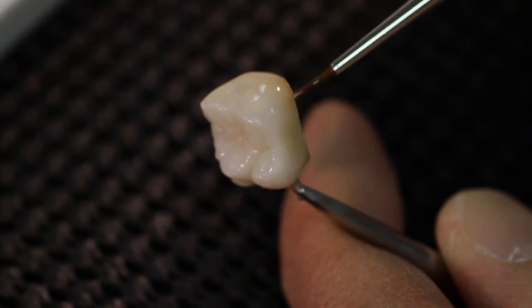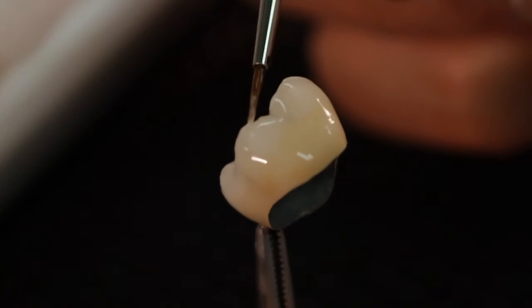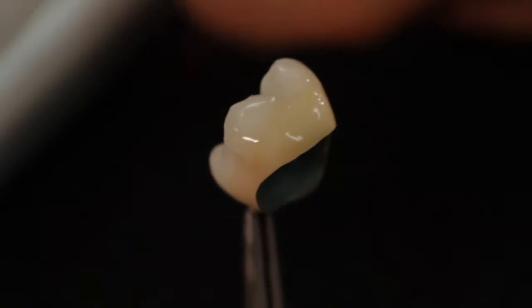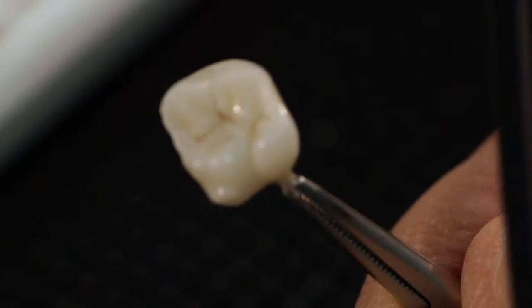All GC Initial MC and Vivo stains can also be incorporated to achieve even more possibilities of individualization. The requested surface texture and smoothness of the Lustre Paste layer can be obtained by soft vibrating or condensing the restoration.